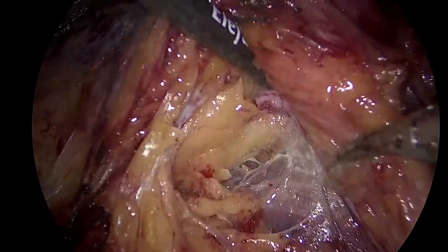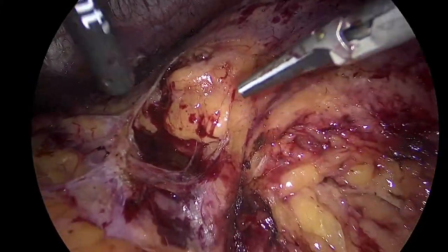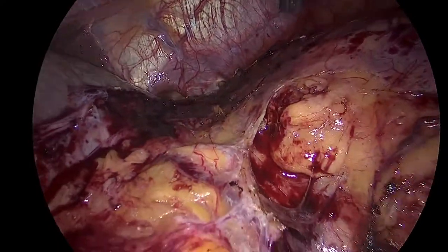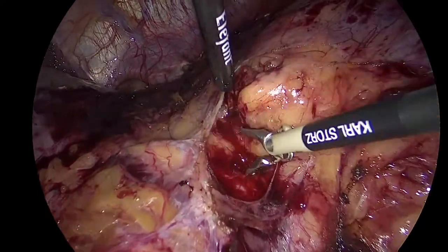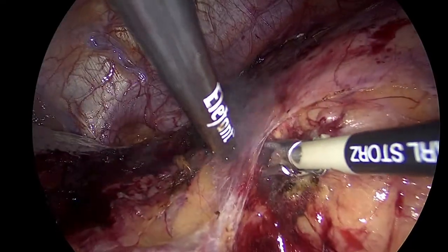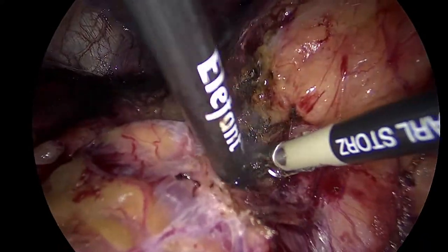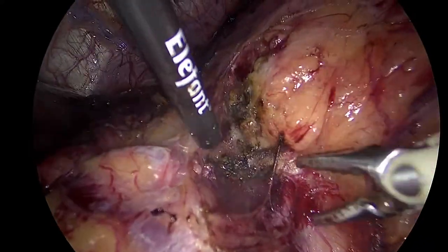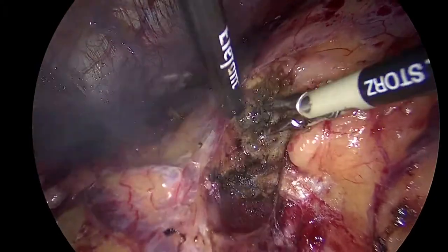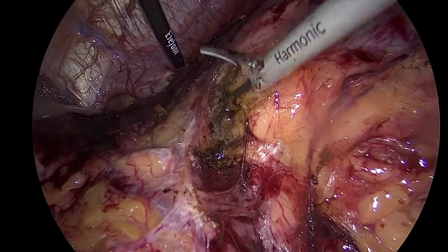Good. Okay, so we clean nicely down here. Show me up. I saw there was something bleeding. Give me the bipolar. I want everything clean here. The adrenal probably. Something from the adrenal, come in. Come close on top. As I said, we want everything clear. Bipolar is fantastic. And it's very nice because you don't need to close it. You just touch harmonic. Come on top here. I want to unify this part here. Come in.